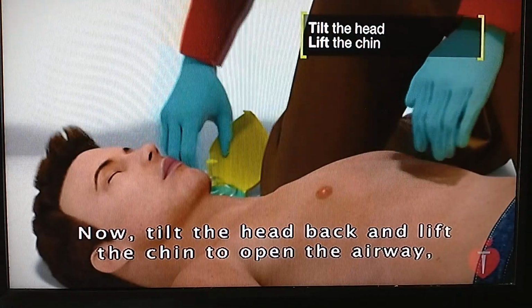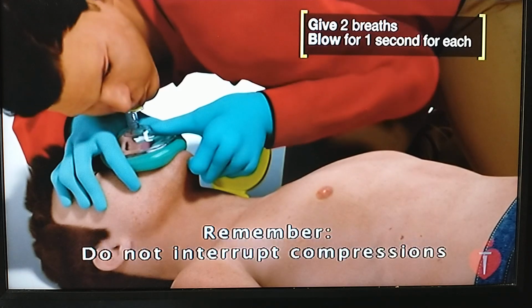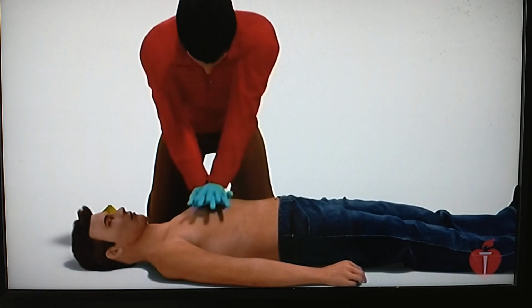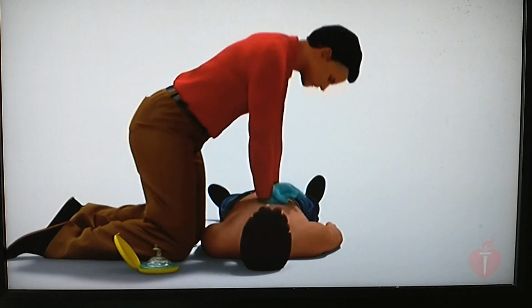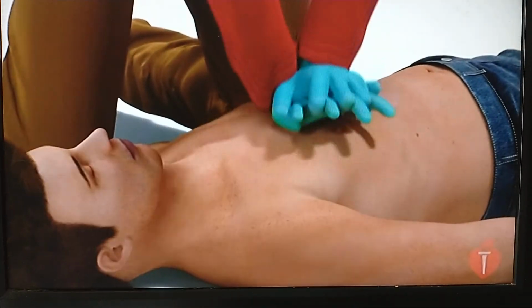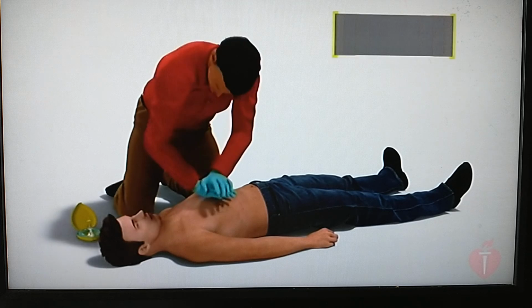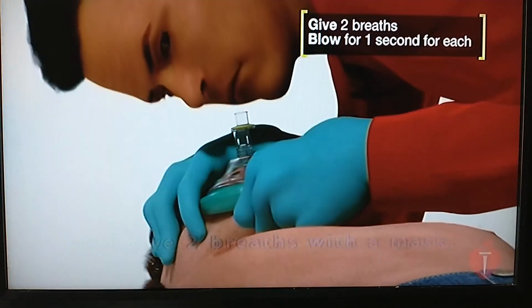Now, tilt the head back and lift the chin to open the airway and give 2 breaths with the mask. Remember, do not interrupt compressions for more than 10 seconds. Repeat. Now, tilt the head back and lift the chin and give 2 breaths with the mask.